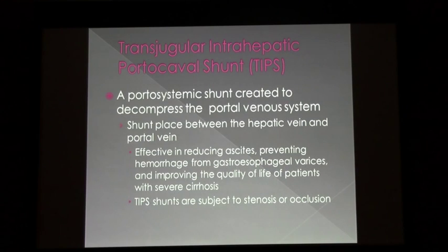This is one of those issues where you probably all need to just sit down and draw the circulation out yourself, and then just sort of see it, and we can talk about plugging it and go through that. That's what I do in my brain when you show me stuff like this, because that's why we look at colors all the time, and look at flow direction and where it is in relationship to the velocity, as Jess was saying, because not all the machines show the inversion or that correction real easy.